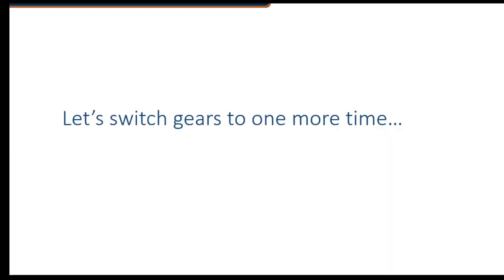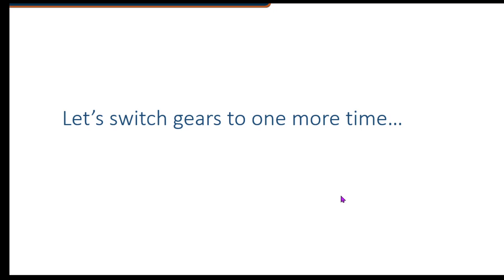We're ready to switch gears. Let's take a look at this thyroid gland — kind of the star of the show. The thyroid gland is going to be that butterfly-shaped structure that overlies the trachea with a lobe on either side and an isthmus joining it. It will have a uniform gray tone, a little bit more hyperechoic — still in that mid-gray, but at the higher end. In comparison to muscle, it is hyperechoic to the muscle.